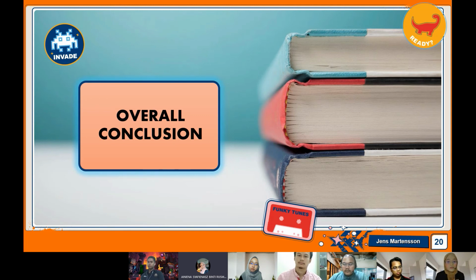With the increasing prevalence of implants in an aging population and increasing demand for MRI in the same group, there will increasingly be a need for imaging centers to be capable of scanning this patient group, opening up the possibility for patients with implants in need of an MRI scan. This requires an educational initiative for changing the risk perception that implanted cardiac devices are always a contraindication for MRI.